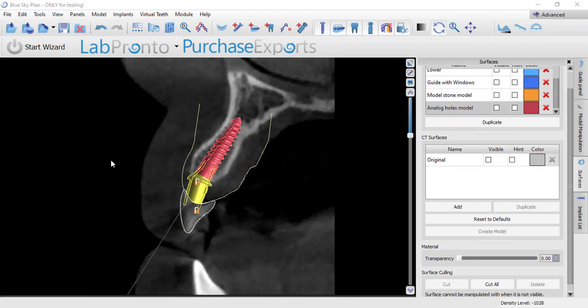Hey, this is Dr. Corey Glenn with Blue Sky Bio. I'm going to be showing in this video something that I've gotten quite a few questions about that people seem to be a little unclear on — and that is how to build in the timing into your implant placement based on your surgical guide.